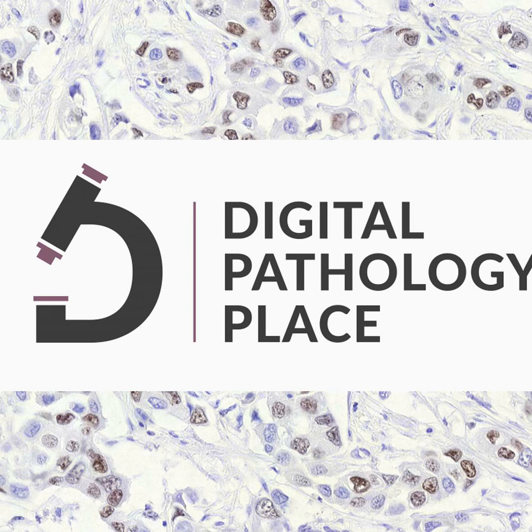Mm-hmm. You touched a little bit on advantages and disadvantages of IF versus bright field multiplexing. Maybe we can elaborate on that a little bit more. Yeah, sure. So in a chromogen, really you're taking a single picture of the tissue with the color cameras on the scanners. And as those chromogens start to overlap and co-localize on a cell, they're going to change colors.